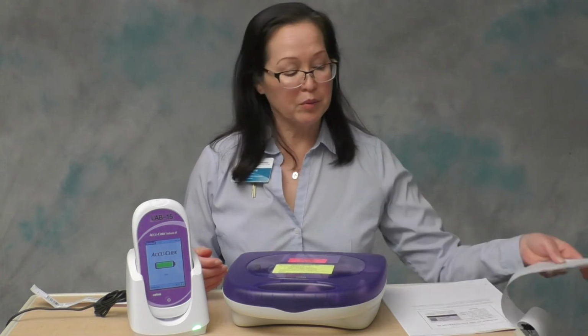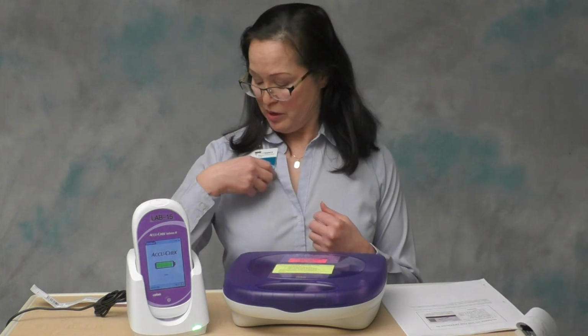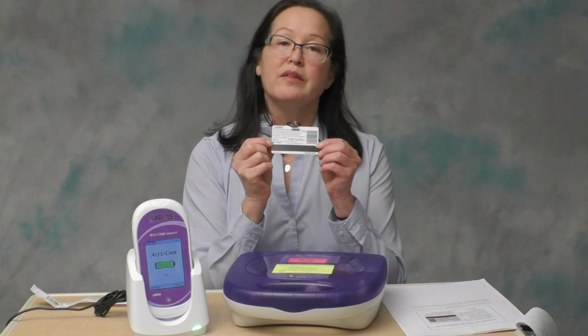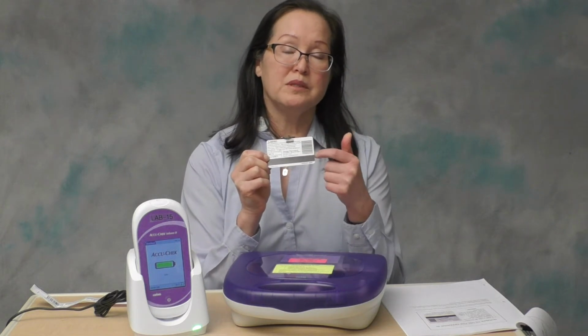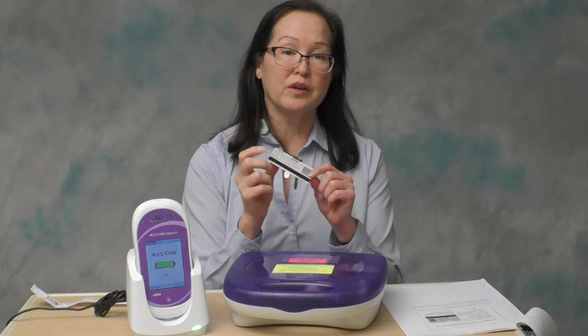I'll start with the number that you will use for your operator ID. We call it the badge ID number. So on the back of your badge, right above the magnetic strip, there's a 6-digit ID number. That is your badge number. It corresponds with the UPC barcode on your badge. This is the only number that you can use for point of care testing.